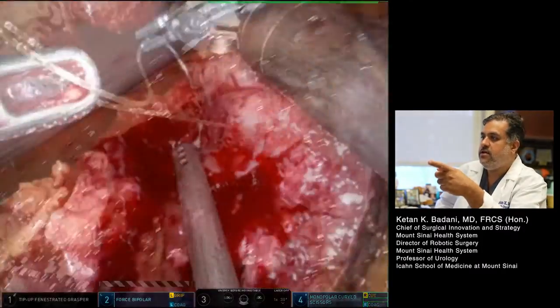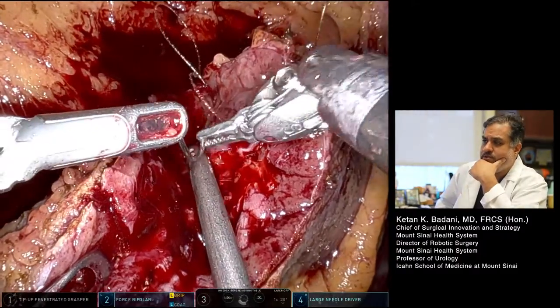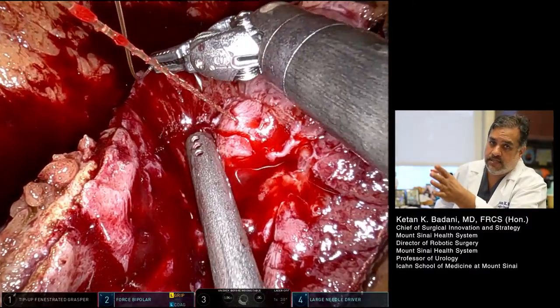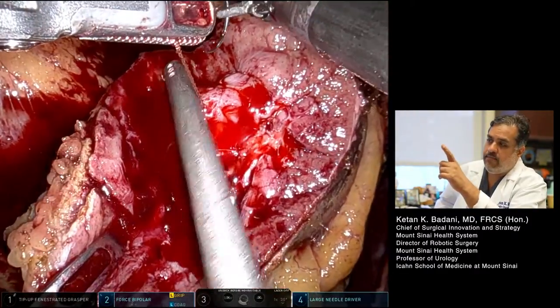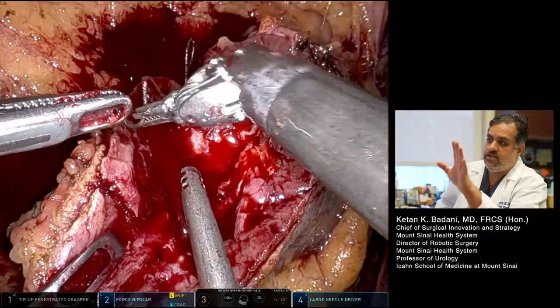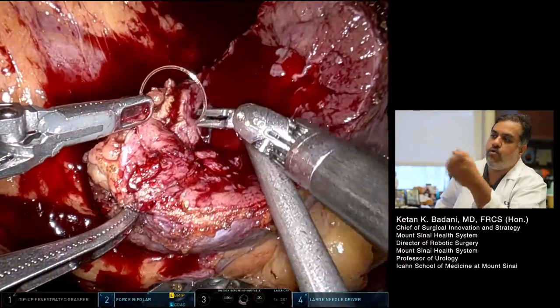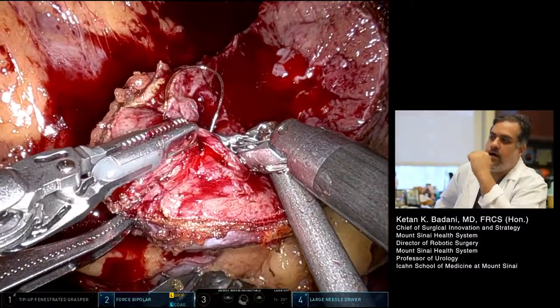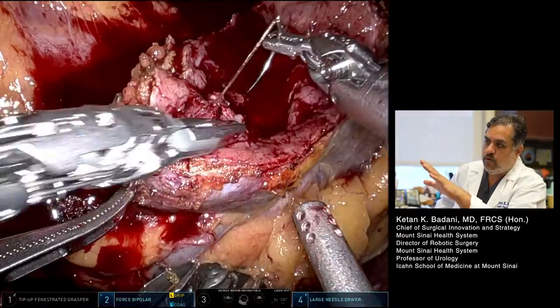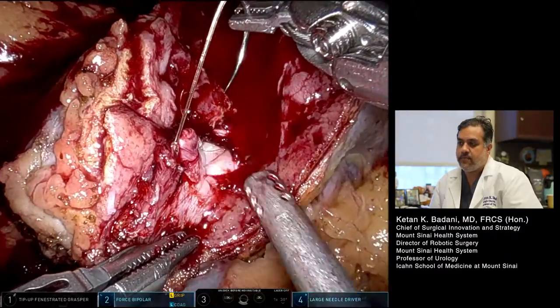The top looks good, the bottom has been widely excised — a lobular tumor. The only instrument change that happens in this operation for me is that the right hand becomes a needle driver; the scissor becomes a needle driver. It is single-handedly the only instrument change on the da Vinci system that I do. I've minimized all the issues that come with instrument changes: the port falling out, the instrument being expired, losing pneumoperitoneum. My assistant can focus on their one instrument port without worrying about changing instruments. I've brought this down to a four-instrument operation.